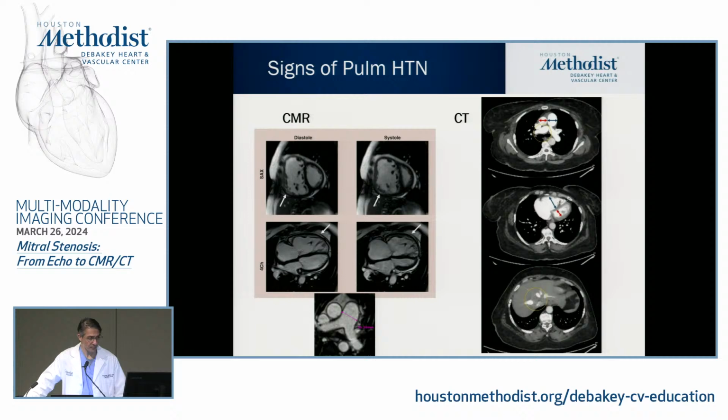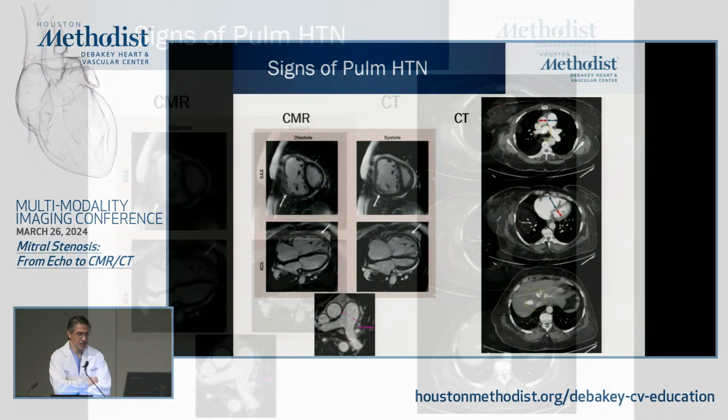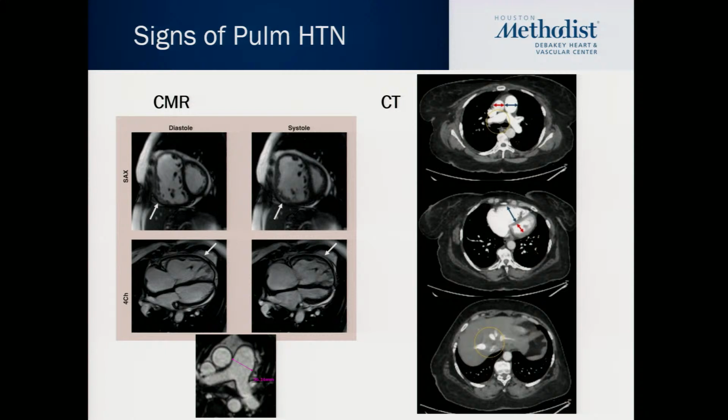A lot of these patients may have pulmonary hypertension. Pressures and flows are transmitted back. And although we cannot measure TR velocities by CMR or CT, we look for signs of pulmonary hypertension in an indirect manner. So both with CT and CMR, you'll see a D-shaped septum or flattening of the septum by high RV pressures pushing the septum towards the left. And so you can kind of see this D-shaped pattern. You can see that in the second CT slice as well. You kind of get a very flattened septum rather than that natural curvature that we're used to seeing.